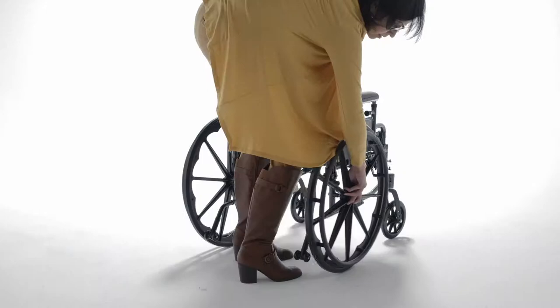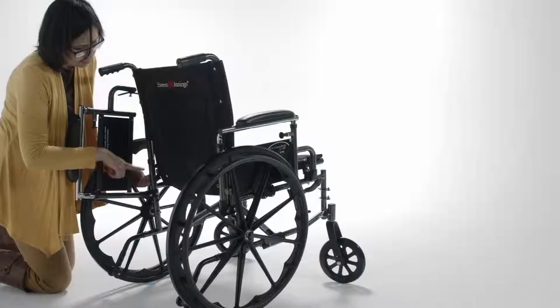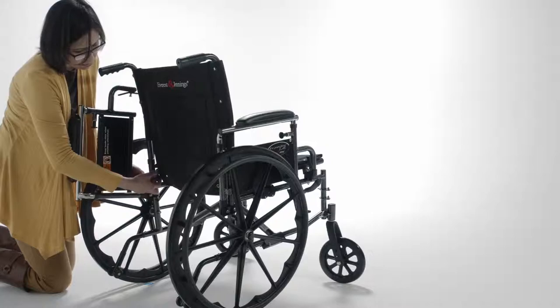Some models are designed with convenient quick-release axles to allow for easier folding and transport when detaching the rear wheels. This feature is convenient, especially for caregivers.